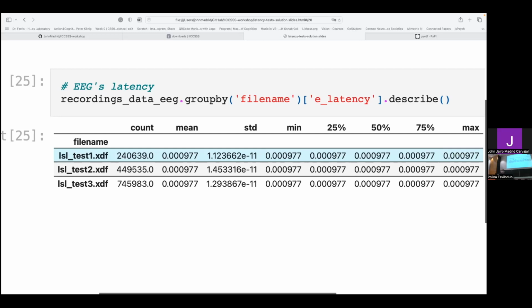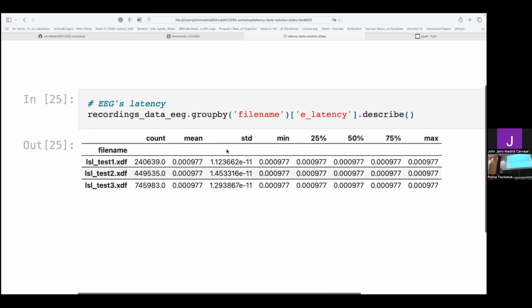when you are designing with Unity, one of the biggest challenges is that the system is always sending the samples in a constant time. If you don't make sure that Unity is sending samples at 90 hertz, say Unity sends at 90, then 80, then sometimes 70, sometimes 80, that will create differences in how much time each sample takes to arrive into the system.